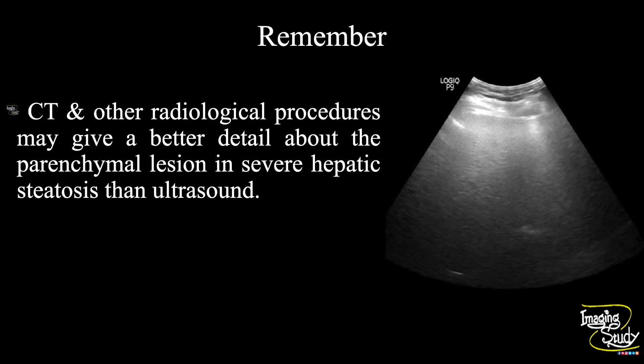The take-home message: severe hepatic steatosis is not a good case to evaluate with ultrasound. It is very difficult to determine whether there is any parenchymal lesion or not. Other radiological procedures like CT or MRI may give you better detail than ultrasound in severe hepatic steatosis.